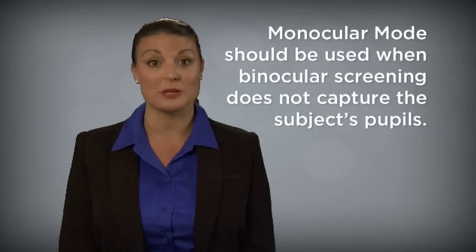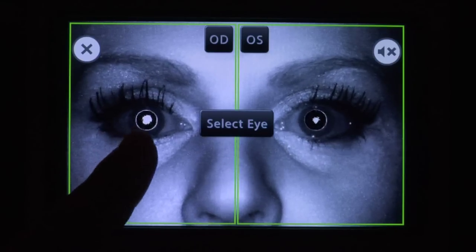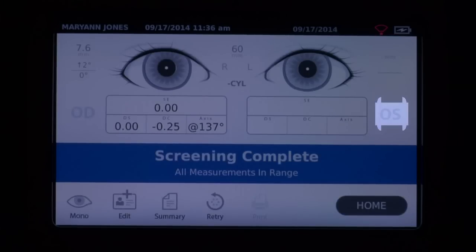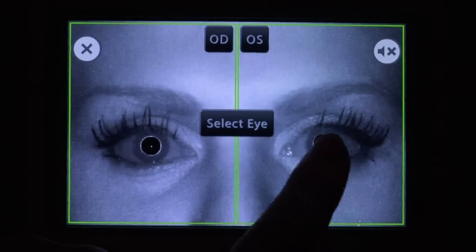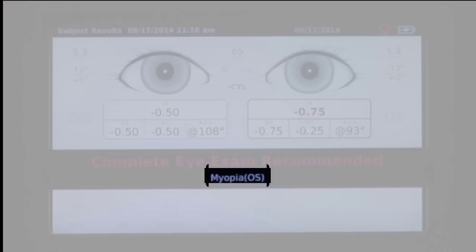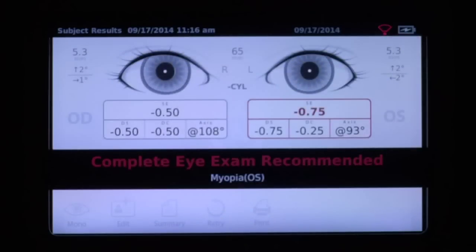Monocular mode should be used when binocular screening does not capture the subject's pupils. In monocular mode, you will be given the option to choose which eye to screen. Touch the side of the screen that corresponds with the eye you would like to screen: OD for the subject's right eye, OS for the subject's left eye. When the initial monocular scan is complete, you can repeat the process with the other eye by choosing Monocular from the Results menu. The Results screen will appear at the end of the successful screening process. In-range results indicate screening complete; results that are out of range are indicated with red highlights displaying the potential risk conditions and display complete eye exam recommended, and should be referred for further analysis by an eye care professional.